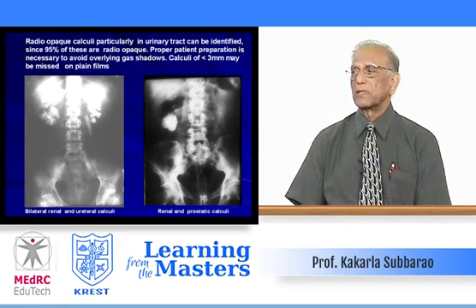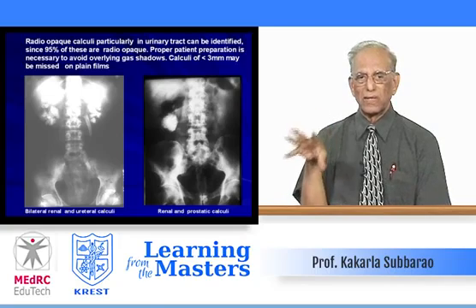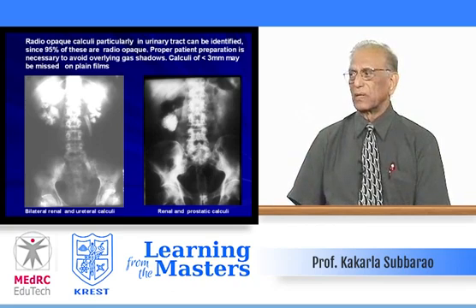Proper patient preparation is necessary to avoid overlying gas shadows. Suppose there is a lot of gas shadow or a fluid-filled intestine, fluid-filled stomach, you may miss a small calcification. Calculi of less than 3 millimeters may be missed on plain films also.